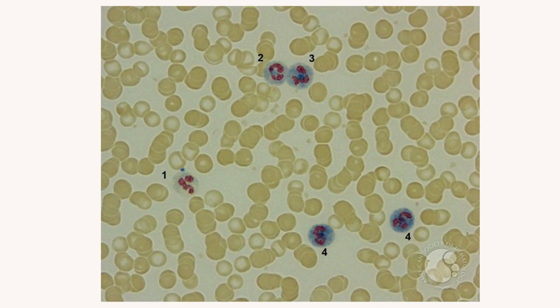The cytoplasm of the cells will be colorless to pale blue. The total rating for the 100 neutrophils is determined by multiplying the number of cells in each group by its rating and adding these numbers together for the total LAP score. The normal range for this test is 30 to 185, but should be determined by each laboratory.